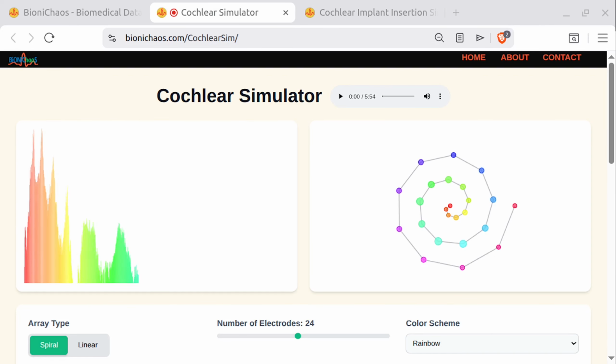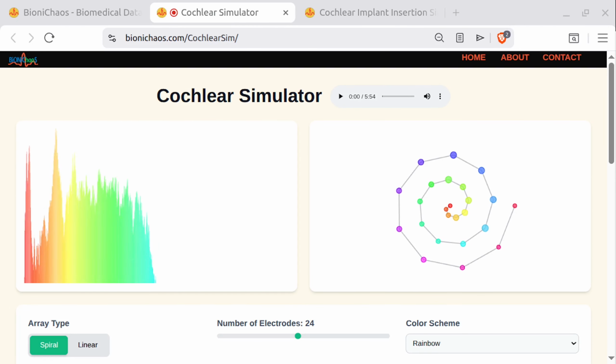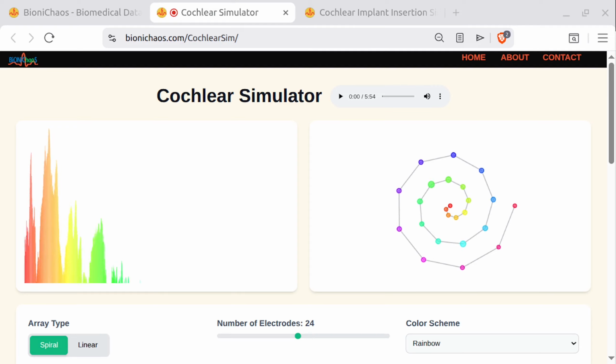Come on. Beyond that, the idea that surgeons are just recklessly drilling through nerves is an incredibly outdated picture. I didn't say recklessly, but it happens. Our precision has evolved immensely, though. We aren't using brute force anymore. In the past, yes, surgeons performed a cochleostomy, literally drilling a new hole through the hard lateral wall of the bone to force the electrode in. Which was highly traumatic. It was.